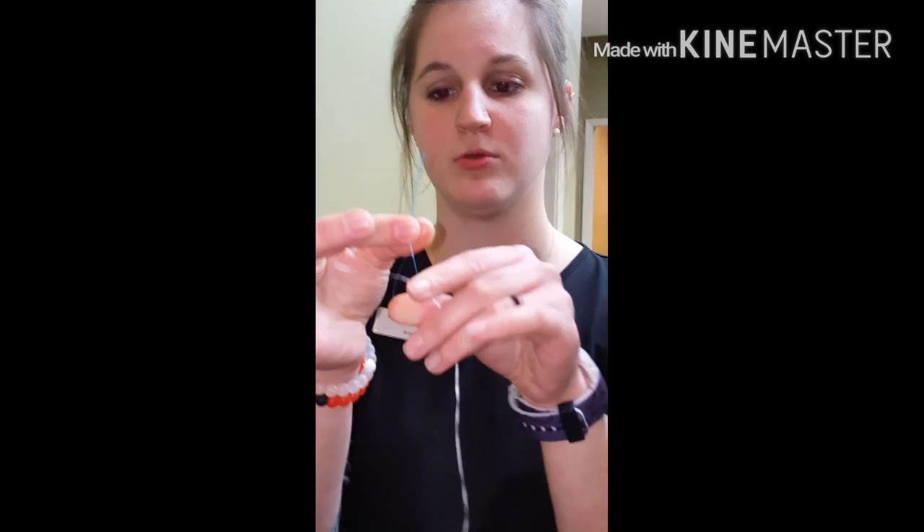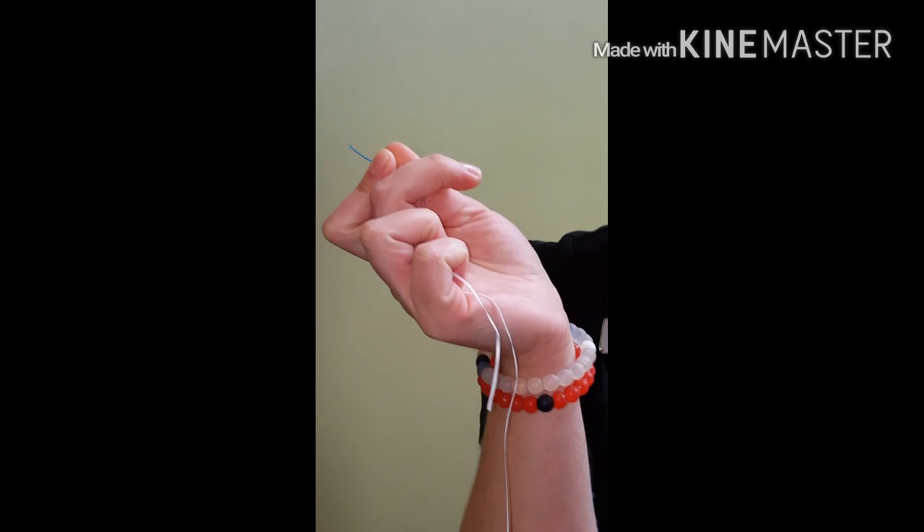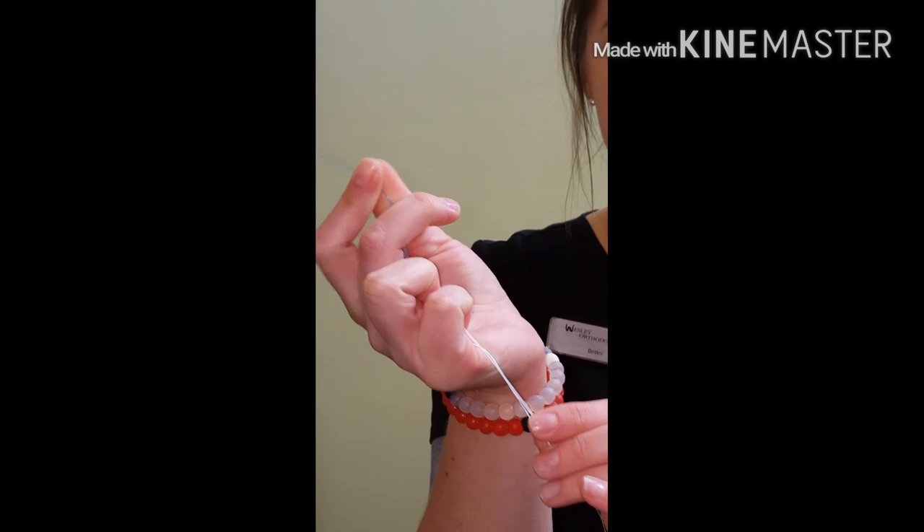To floss, what you will need is a floss threader and any type of floss you like to use at home. You want to take your floss threader, take the floss, thread it through the loop, and pull your small end through. I usually like to hold my small end in my pinky or my fingers so I don't lose it.